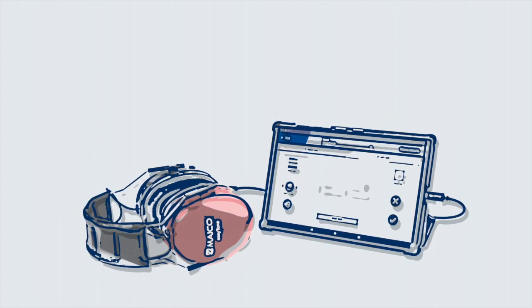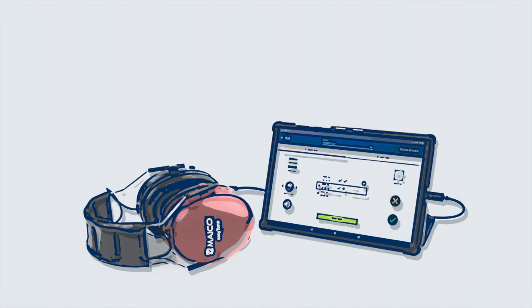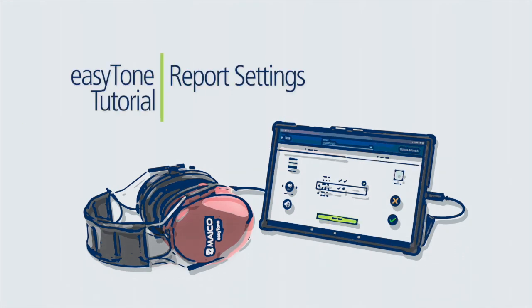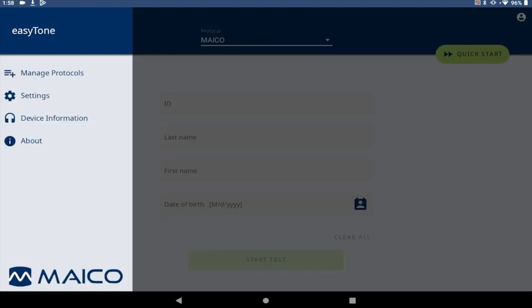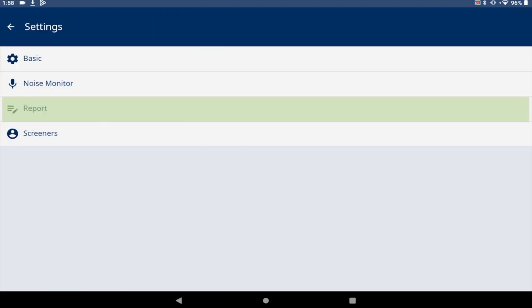This tutorial shows how to add facility information to the report printout and review all report settings. To access the report settings, select the hamburger menu in the top left corner, then select settings and then report.